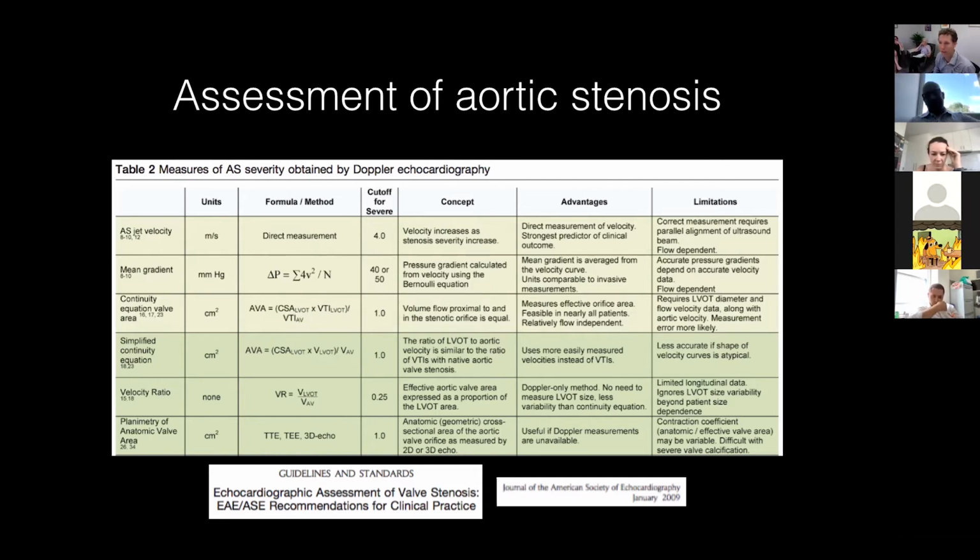Yes. And again, the little tip and trick I have for that, it's a bit like we're doing it with the ejection fraction I talked about a couple of weeks ago. You don't look at your cursor, you look ahead of your cursor. It's like driving a car. You look past the bonnet and the car kind of follows it. Same thing. You look ahead of where your cursor is and your cursor will follow it nicely.